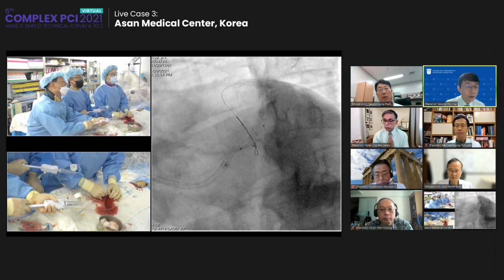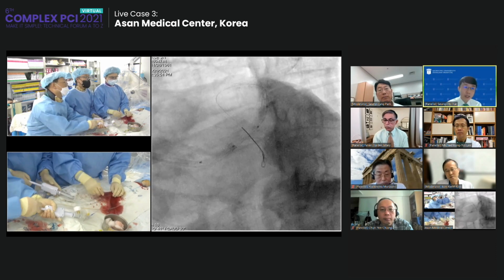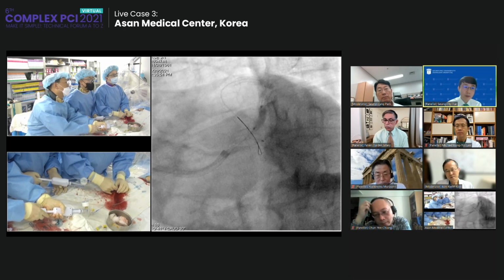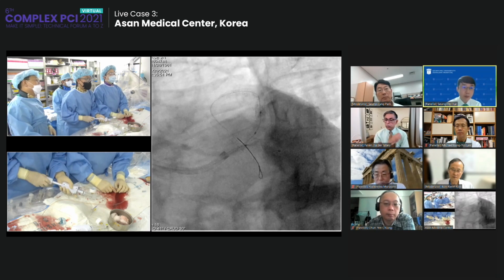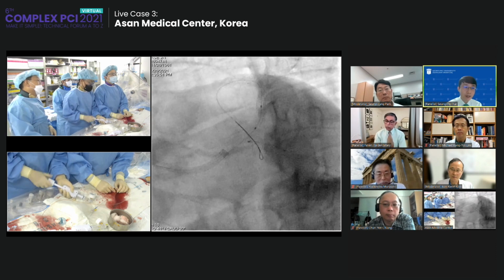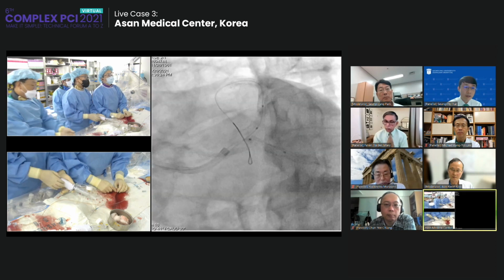I have questions. This patient received PCI 1 year ago, the ISR, put another stent or something like that. But what about the left main disease at that moment? Is this the progress, or the same as the angiogram 1 year ago? Just some left main part?